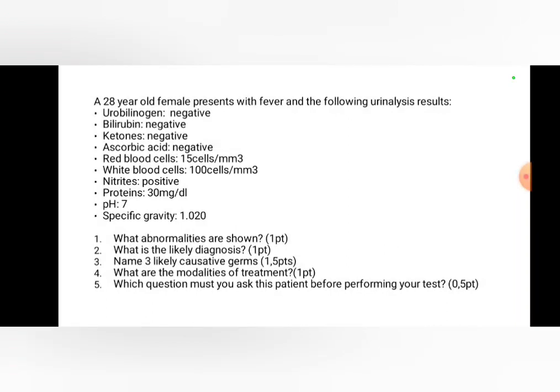Is it clear? So you have a diabetic ketoacidosis when you have at least 2+ of ketone inside a urine dipstick. When you have at least 2+ of ketone inside the urine dipstick, it tells you that there is a diabetic ketoacidosis. Is it clear? The ketosis portion of the diabetic ketoacidosis is with that ketone.